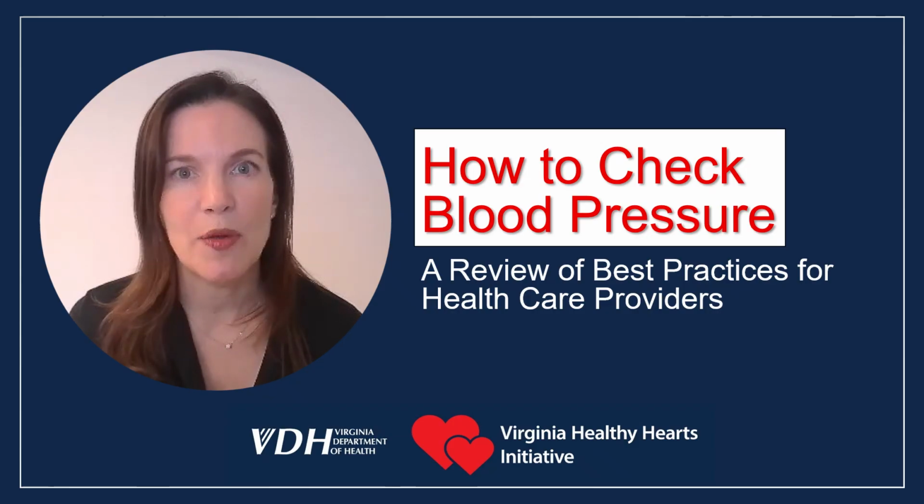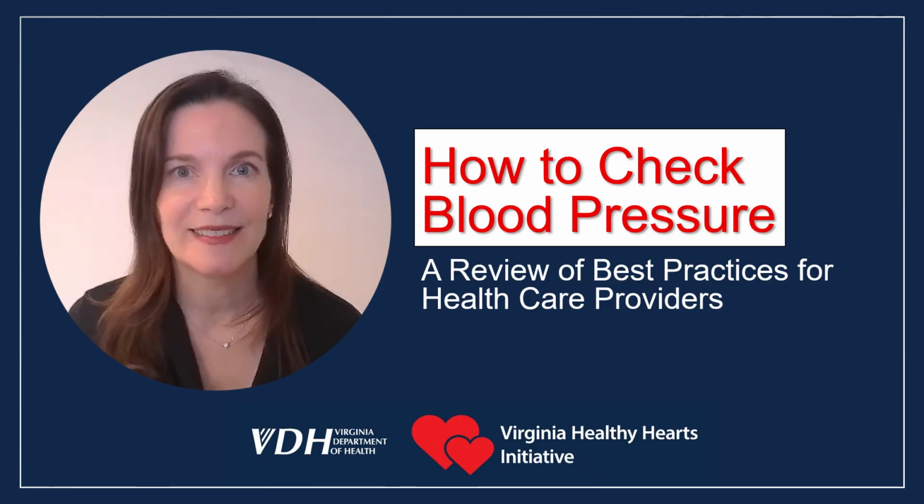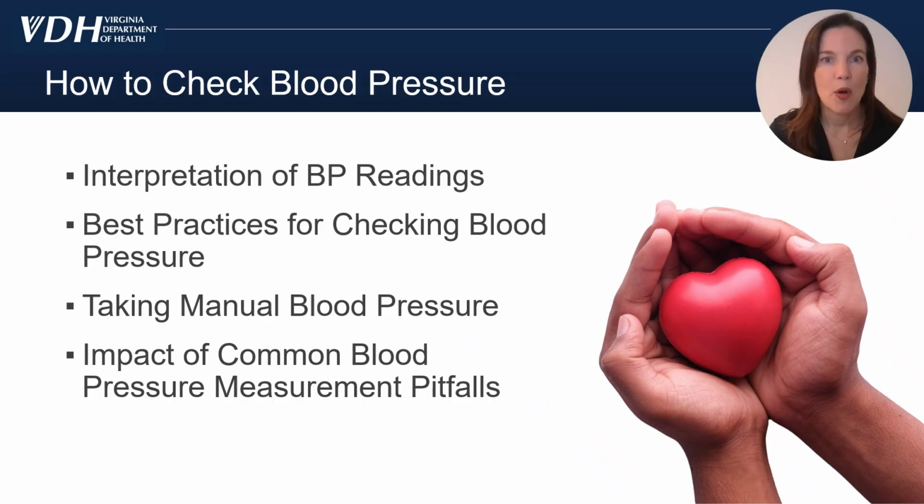Today, we're going to be reviewing best practices for checking blood pressures in the clinical setting. We're going to start with a brief discussion of how to interpret blood pressure readings, move on to review the best practices for checking blood pressures and how to check a manual blood pressure, and then finish by discussing the impact of common blood pressure measurement pitfalls.